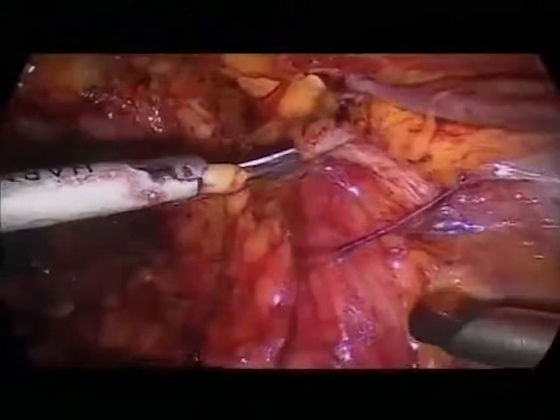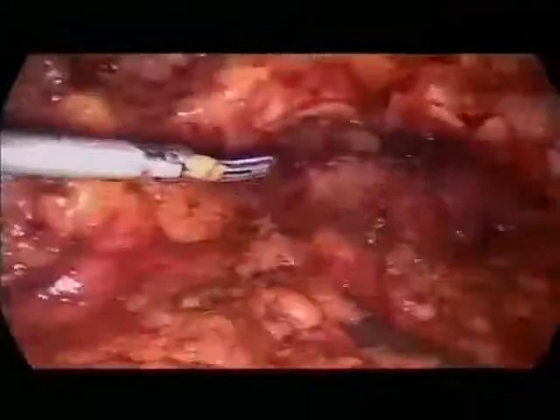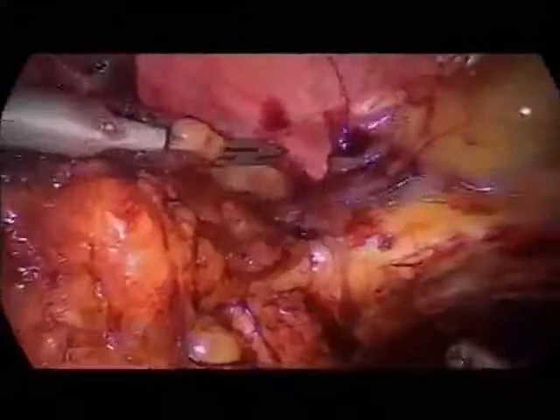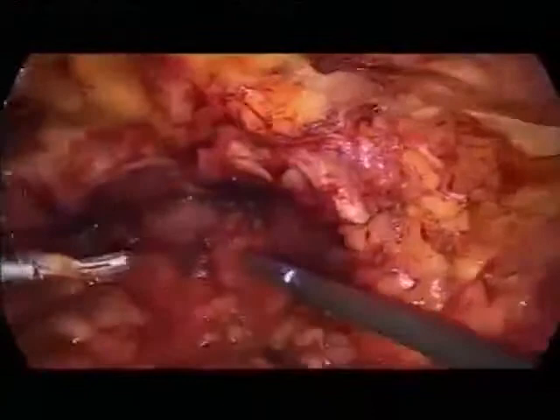These are the epigastric vessels. This is the spermatic cord here, this one. And the same situation on the other side, these epigastric vessels. And here, the patient probably will develop a medial hernia defect. You see it here. It's not really a hernia, but it's an area where probably in some years the patient has a hernia. So we go down.